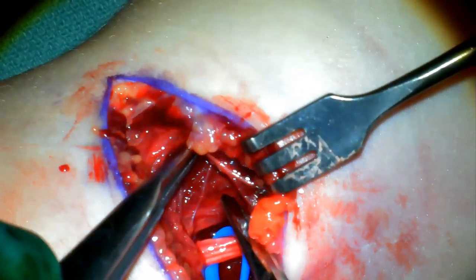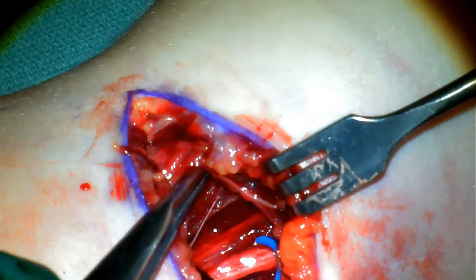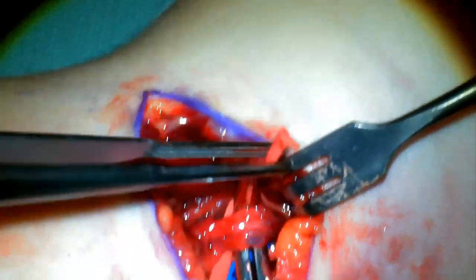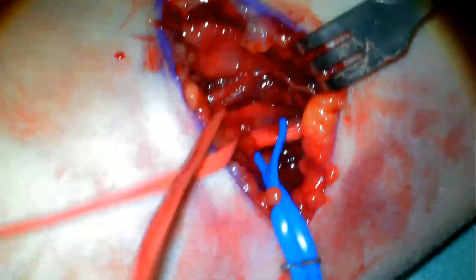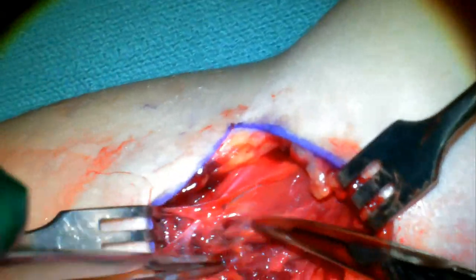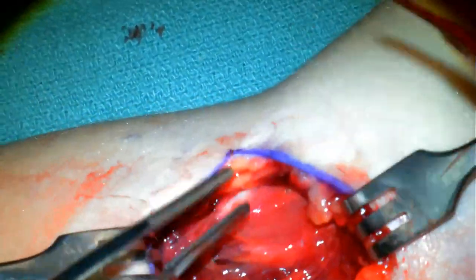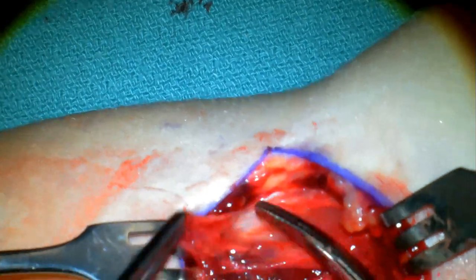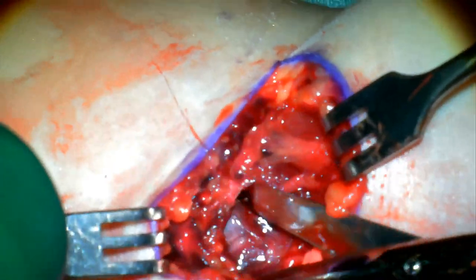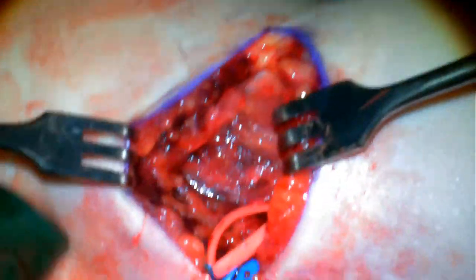Next, we identify the brachial artery. It's actually the vascular bundle, as there's the artery and two venae comitantes with it. So that's going to be your biceps tendon there, and that's going to be the lacertus. It's important to release the lacertus, as this can be a constriction point for both the brachial artery and the median nerve.